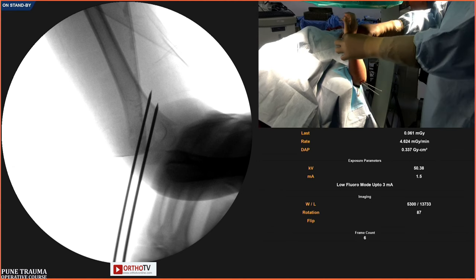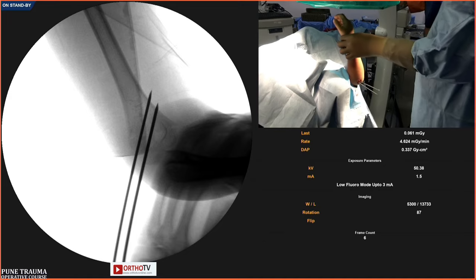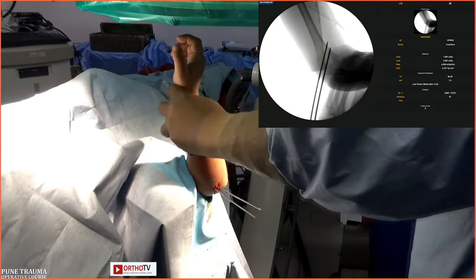And now that the surgery per se is over, we bend the pins and I'm going to show you the plaster application. Sandeep, also the surgery is over but questions are still on. Dr. Agashe has a question.